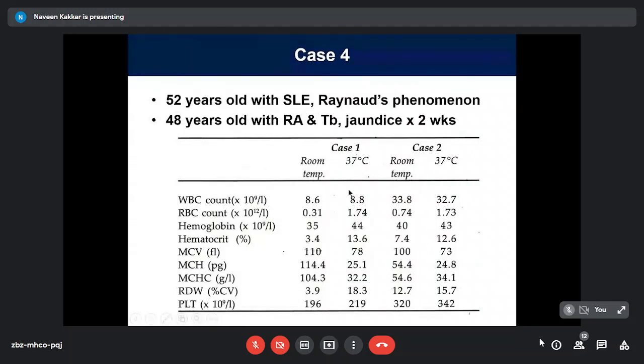So you warm the sample at 37 for about 20 to 30 minutes, and what do you get? Normal values. Everything back to normal, indices are normal here, same there. And if you look, your hemoglobins have not changed much, because hemoglobin is a function of spectrophotometric lysis within the machine. It is nothing to do with counting of red cells. That's why hemoglobins are consistent. TLCs have altered a little bit, but not much. Rarely you can have agglutination of WBCs also in the same sample, but unusual. So this is predominantly a red cell agglutination, and this solves the problem.